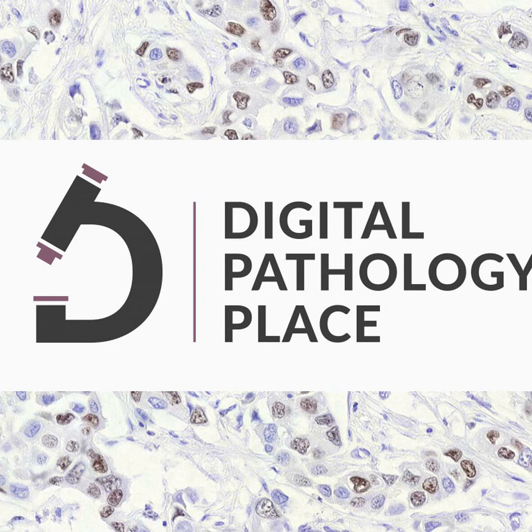And we do that through what we call spatial analysis. So you're measuring the expression level of those neighboring cells and its proximity to the target positive cell to get a score. If there are more tumor cells close to those target positive cells, then you're more likely to have that bystander effect, and you're going to be more efficacious for that therapeutic. But it is a different metric. It's a different scoring metric.